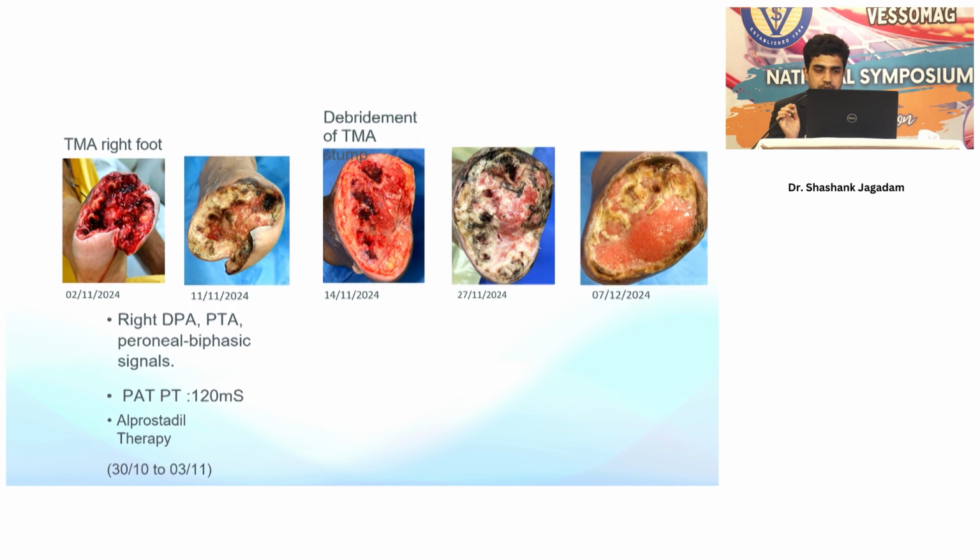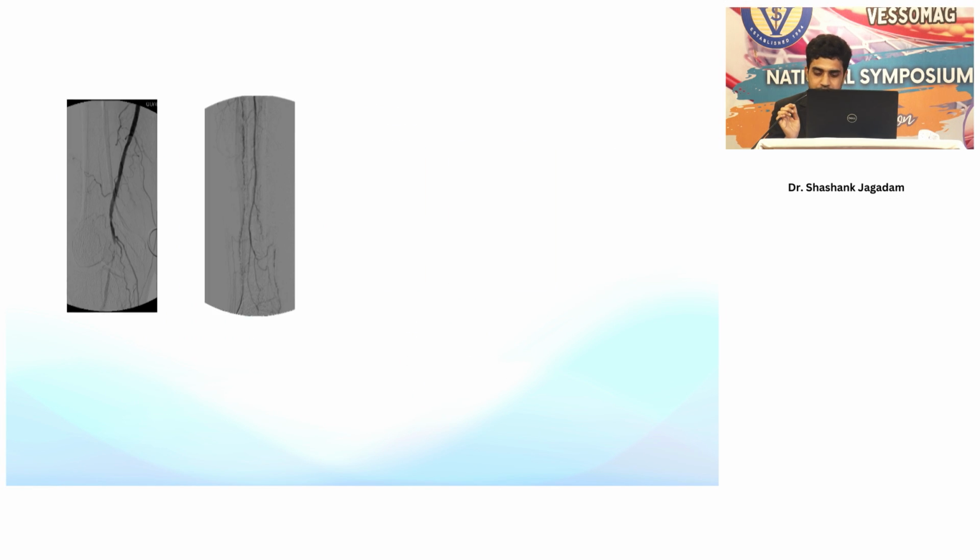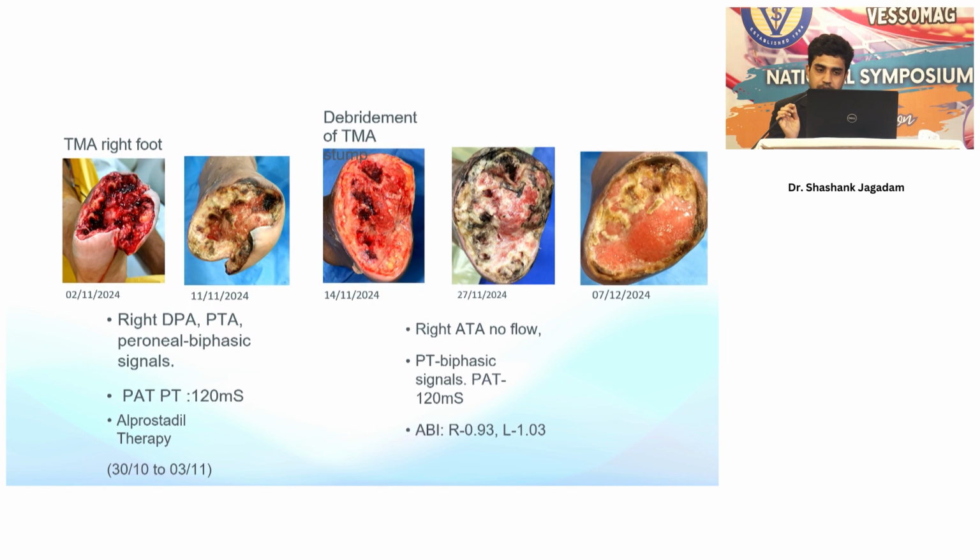There was poor wound response after 14 days, and though the ABI showed improvement and PAT was still 120 milliseconds, there was poor wound response, so we had to take him up for repeat tibial angioplasty. This is the latest status of the wound taken on 7th December.